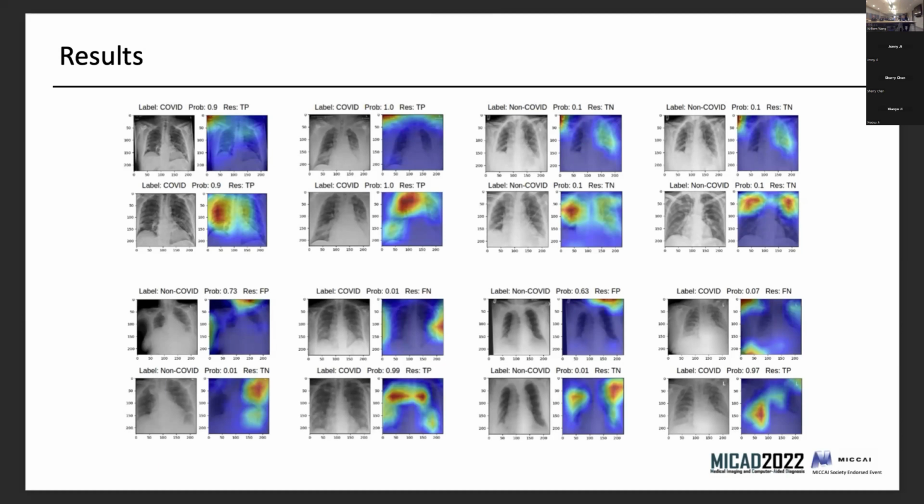So that just goes to show that having more standardized data within your deep learning model helps to improve performance. And even more interestingly, on the bottom, using pre-processing can get the classification from a false positive in this case to a true negative, just because the model probably saw something within the head of the patient here or on the side, and made a wrong prediction, while focusing on the lungs, it was able to achieve the correct prediction.